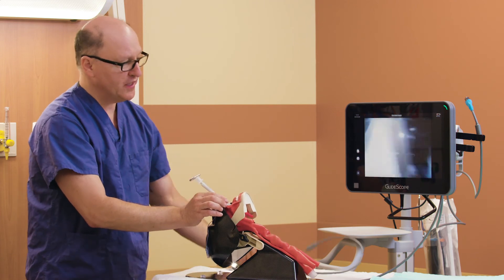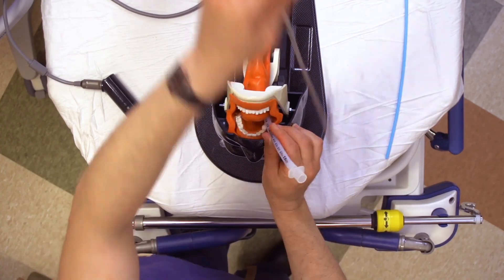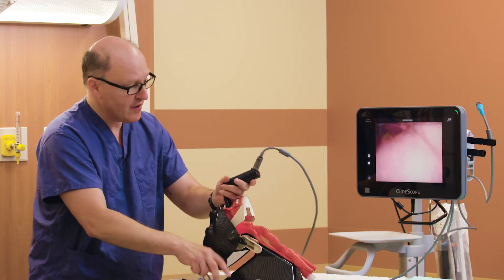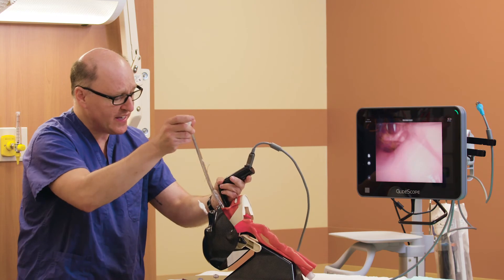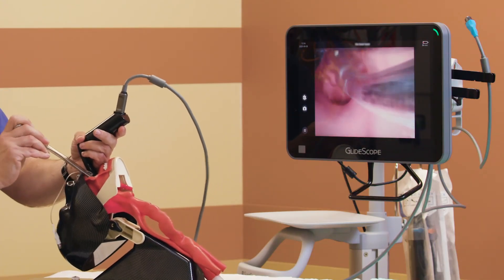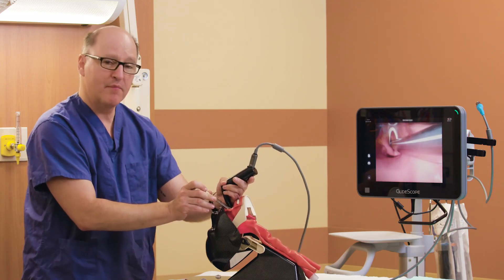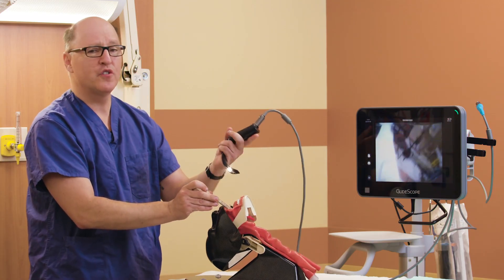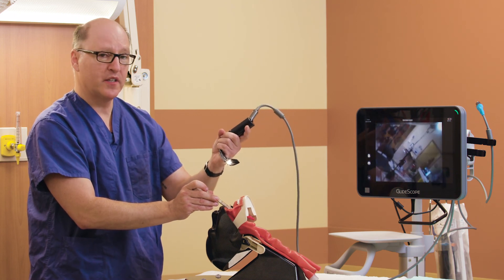I check the depth of placement before removing the blade and also before removing the stylet. The tremendous advantage of video laryngoscopy is the visualization of the tracheal tube going through the cords and the fact that everybody in the room can see that. To me, that is a huge advantage for using video, even if you're using a Macintosh blade.